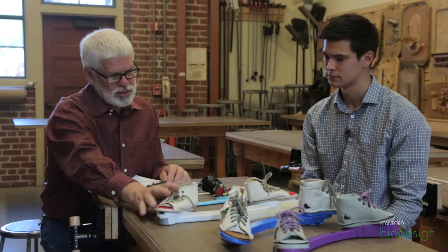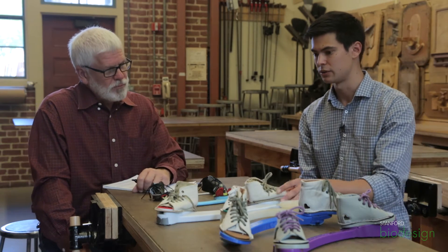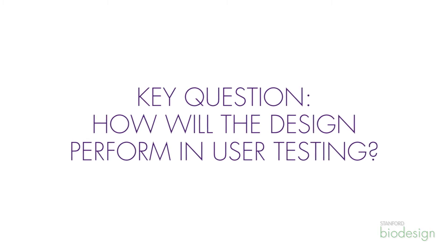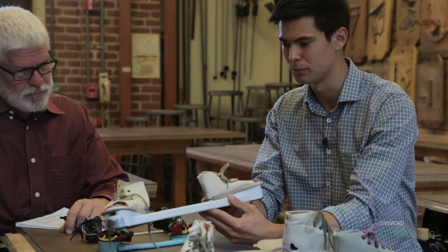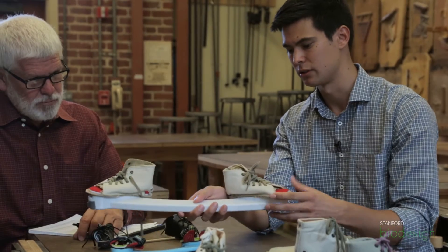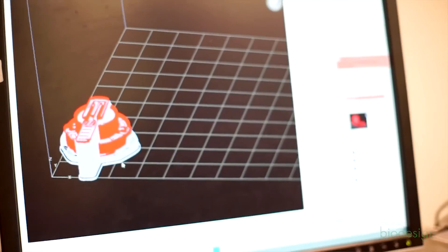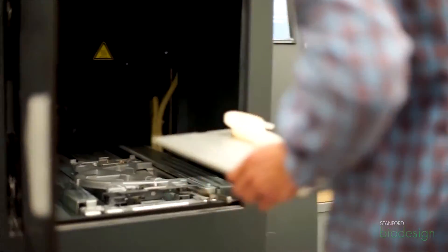This third prototype here — how is this different than this one? I see it's a different size, but is it different in other ways as well? With this prototype we wanted to create something we'd be able to test on someone. These are both 3D printed, but this one uses a more durable material. We also made it bigger and a little thicker. The shoes still clip on and off via a different mechanism that we thought would be stronger. We actually did test this one out and it did end up breaking, so that's how we knew we needed to move up to a stronger material.